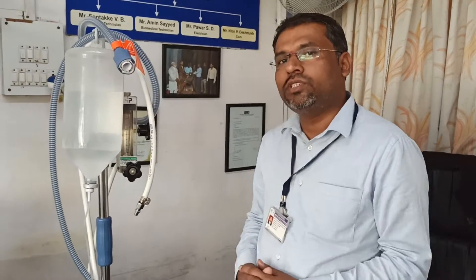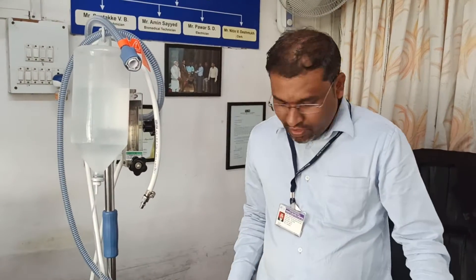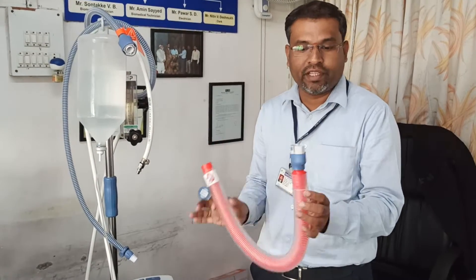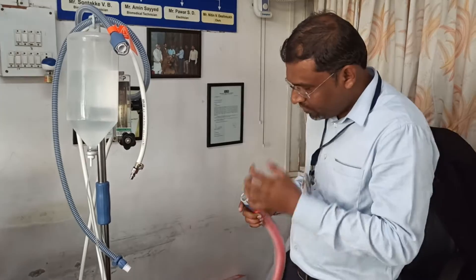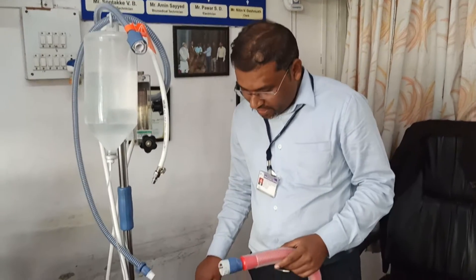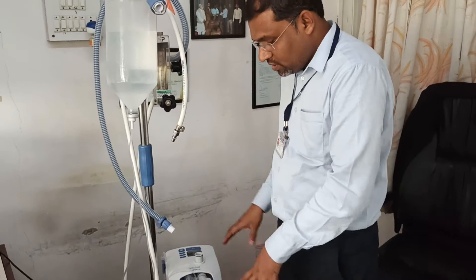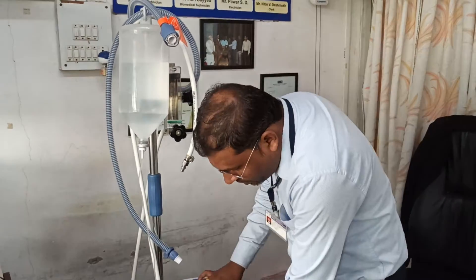There are different protocols to disinfect this machine. With this machine, the company has provided such type of tubings — a red color tubing is there. One connection you have to connect here and the second one you have to connect at the left side. Before starting this disinfection, you have to remove all the things.